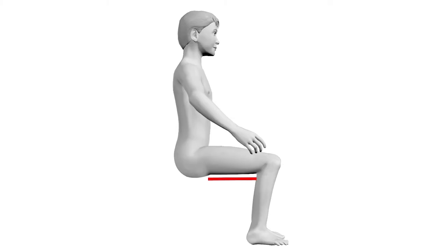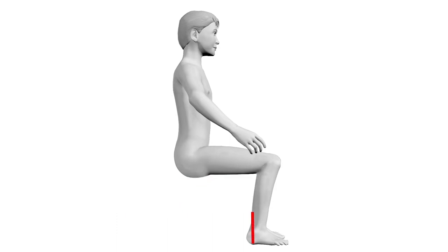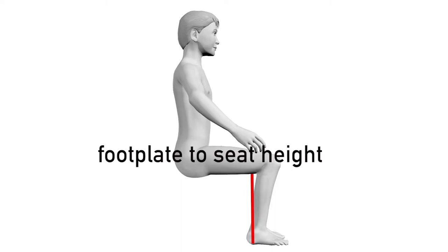Step 1: Measure the Child. Measure the child from the back of the leg to the back — this is your seat depth measurement. Next, measure from the bottom of the heel to the back of the knee — this is your footplate to seat height.